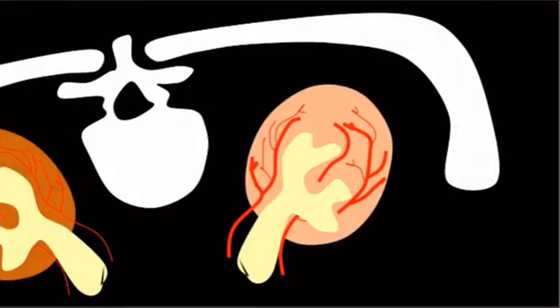The next thing, and I change the color of the kidney to make the vessels easier to see, is you want to pick an entry site that's around 30 to 45 degrees. You want to hit a peripheral posterior calyx. And the reason that you do these things is this idea of this bloodless line. Notice how the vessels here are sort of on one side and then on the other, and then right through here is this quote-unquote avascular line. It's not truly avascular, but it's less bloody than it would be if you went through here.